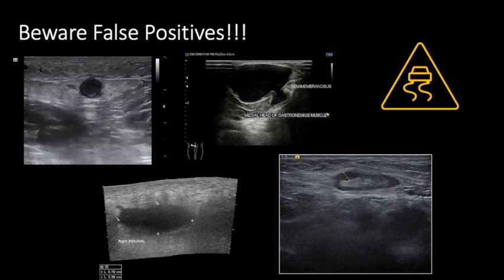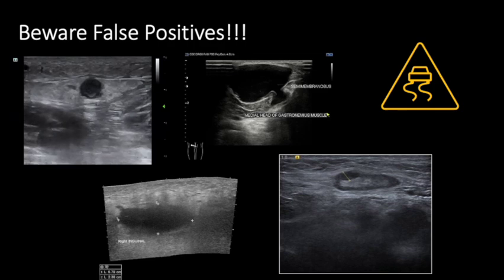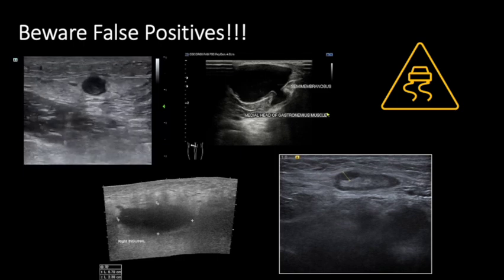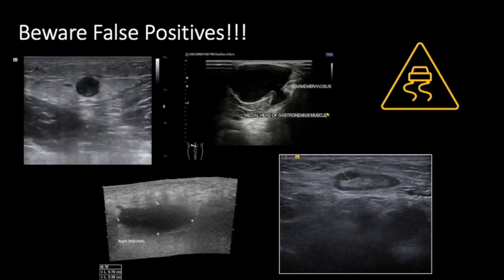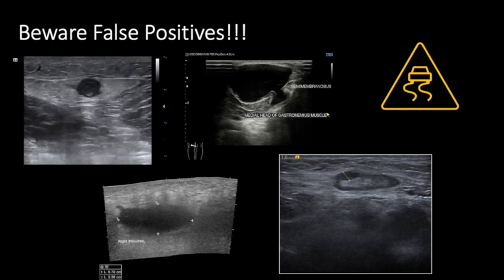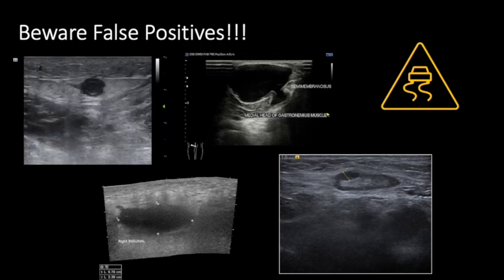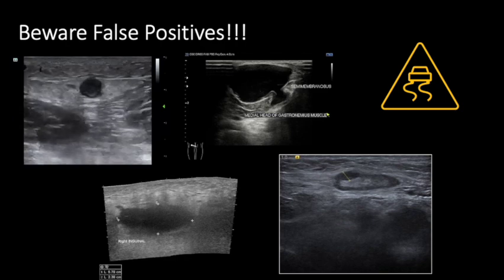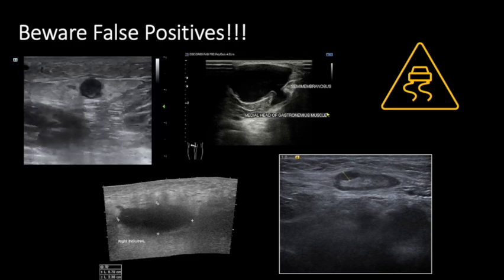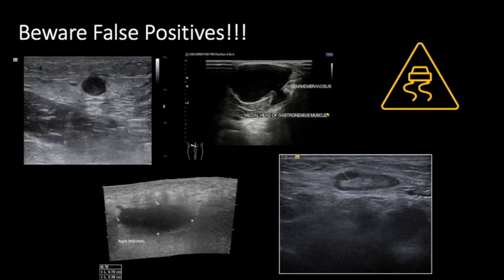There are also findings that can mimic non-compressible vasculature and thus be falsely diagnosed as a DVT. In the upper left image, we see a non-compressible vessel, but this is actually a superficial vessel — superficial thrombophlebitis — typically managed with supportive care, warm compresses, and monitoring rather than anticoagulation straight away, though this depends on the patient and provider preferences. The upper right image shows a Baker's cyst, identifiable by fluid tracking without internal flow on color Doppler, with a connection to the joint space between the semimembranosus tendon and the medial head of the gastrocnemius muscle. The bottom left shows a hypoechoic inguinal mass, probably a hematoma — a smaller one could mimic a DVT — so it's important to trace findings proximally and distally to confirm the non-compressible area is indeed a vessel.